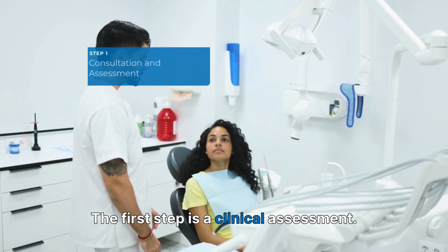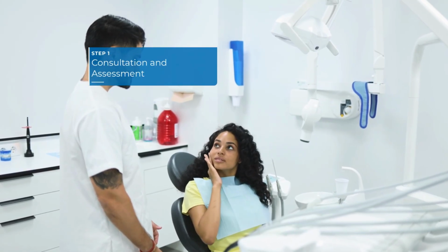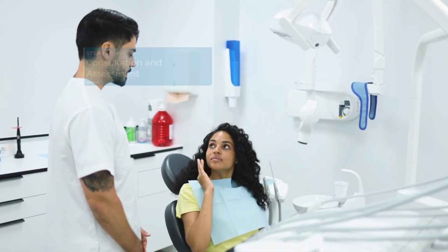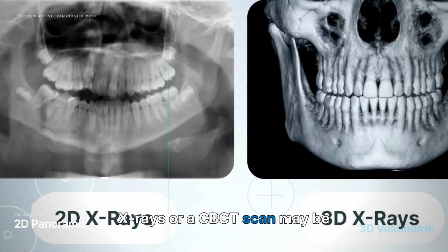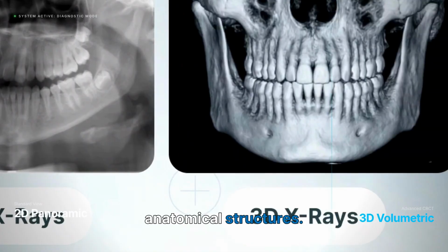The first step is a clinical assessment. The dentist reviews your teeth, gums, bite, medical history, and treatment goals. X-rays or a CBCT scan may be required to assess the jawbone and nearby anatomical structures.